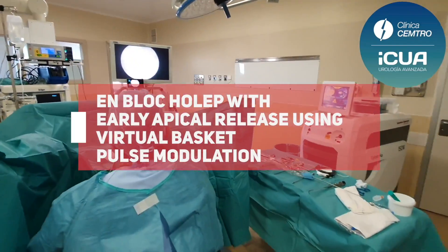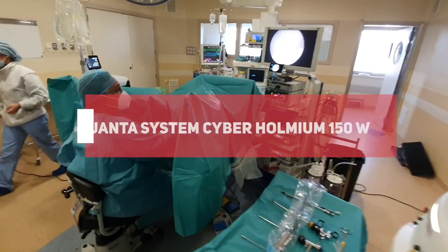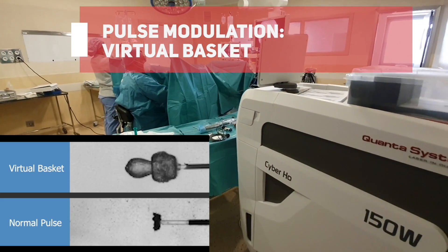EnBlock-Holep with early apical release using virtual basket pulse modulation from Quanta System. This pulse modulation provides better cutting and hemostasis.